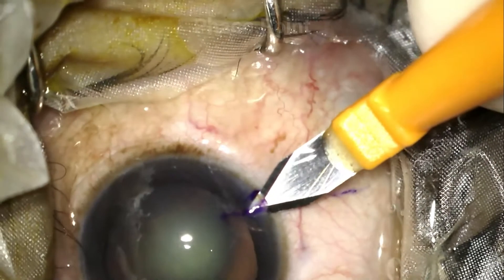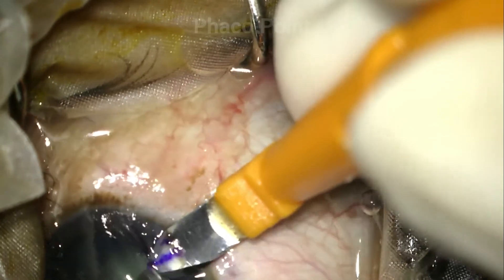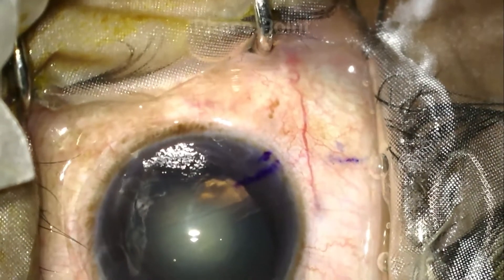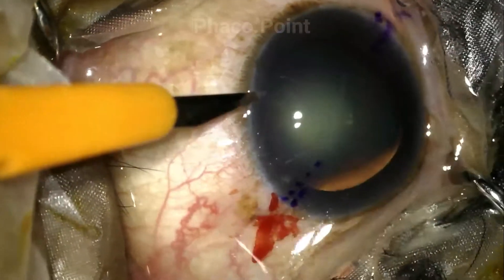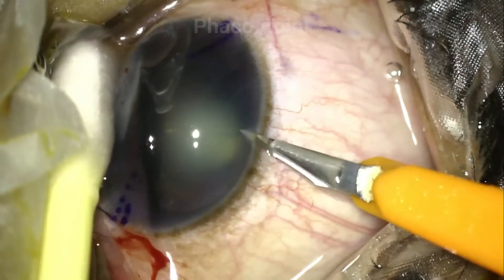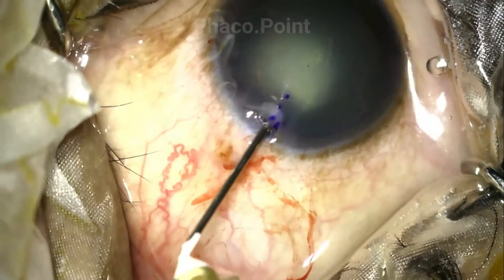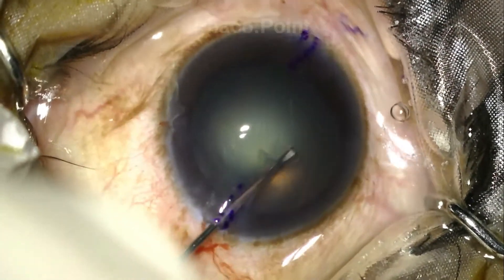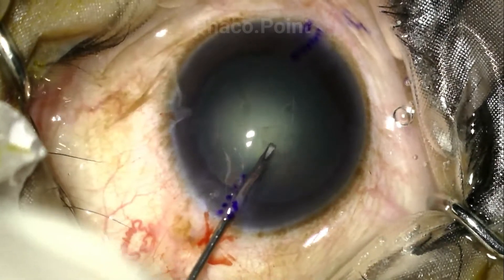An opposing clear corneal incision is fairly challenging to create because you're often making it with a non-dominant hand in a position you're not used to, but it works quite well in reducing the cylinder if the patient doesn't agree to a toric IOL. This is followed by the creation of both the side port entries, the capsulorrhexis, and in this patient with a grade 2 polar cataract, a hydro-delineation to delineate the endonucleus, after which we proceed with FACO.